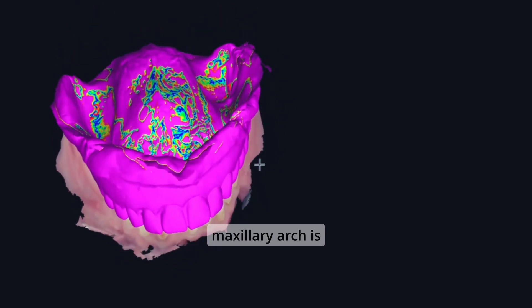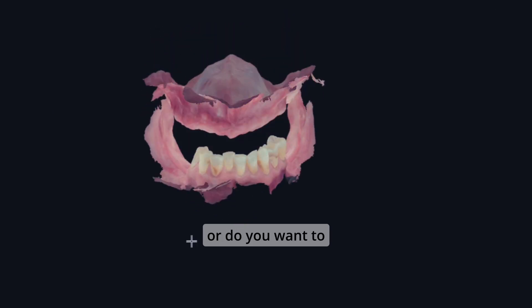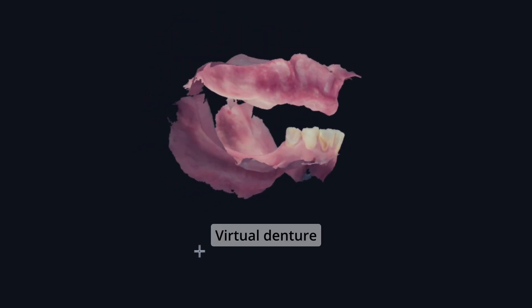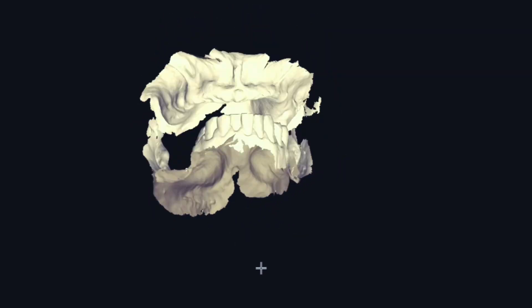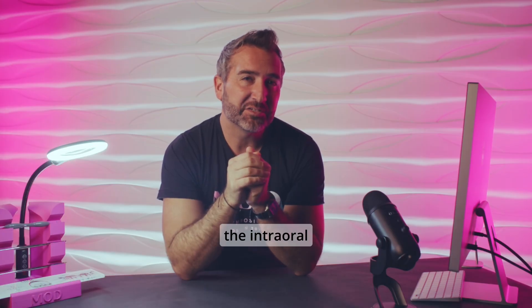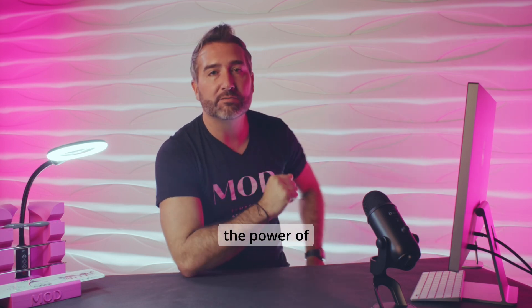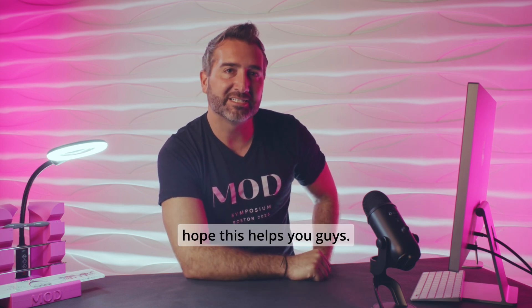The maxillary arch is going to be aligned and you can decide: do you want to design your new denture using the intraoral scan of the soft tissues, or using the poured-up virtual denture made from the 360-degree denture scan? I personally like designing from the intraoral scan, but I love having options — and this is just the power of digital dentistry at its finest. Stay tuned for more top tips from the Mod Institute. I hope this helps you guys.